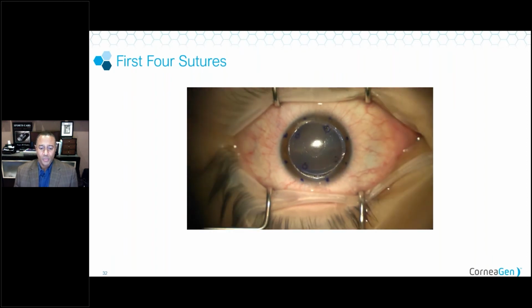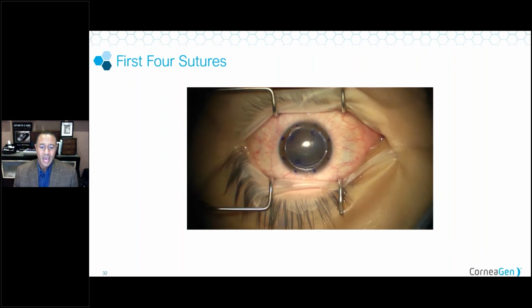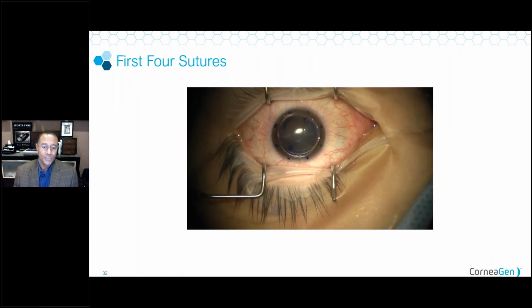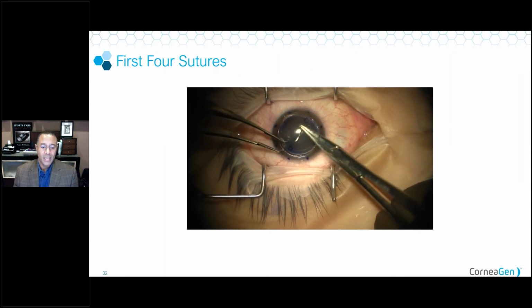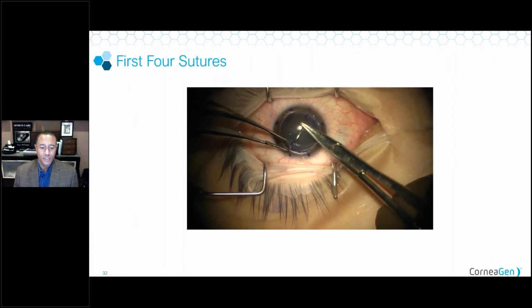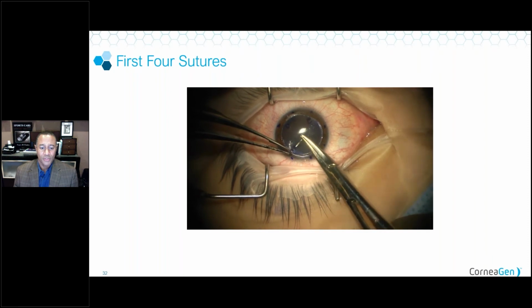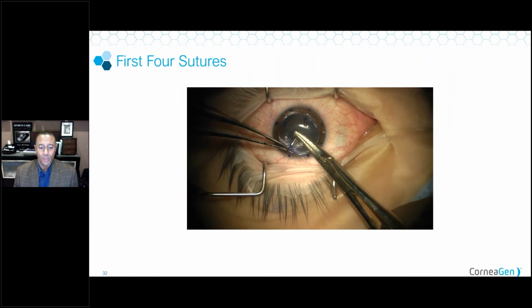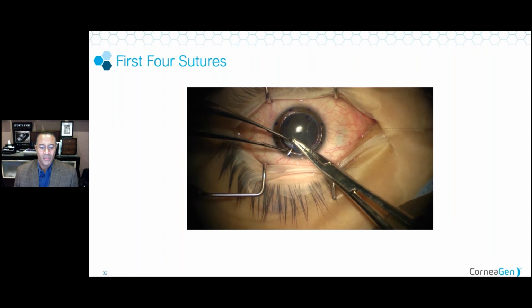Next step is, of course, putting in sutures. I'm not going to torture you guys through all the suture placement, but I do want to point out how sutures should be placed in this. We really want that donor tissue to dive into the wound edge. And so we're going to place the first suture through that dot that's made by our donor trephine, usually either in the center or towards the more central portion of the mark there. And we want to come out on the edge.